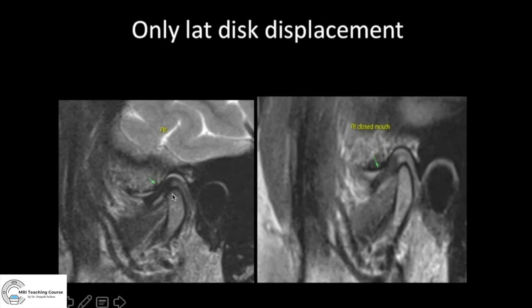In this case, only the lateral portion of the disc was displaced, not the medial portion. If you look at the medial portion, it looks fine — at around 12 o'clock. But when you come more laterally, you can see it is displaced anteriorly. Sometimes only on the coronal image can you detect lateral displacement of the disc, so make sure you look at all planes.